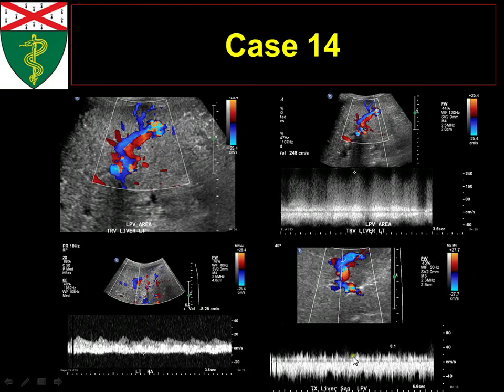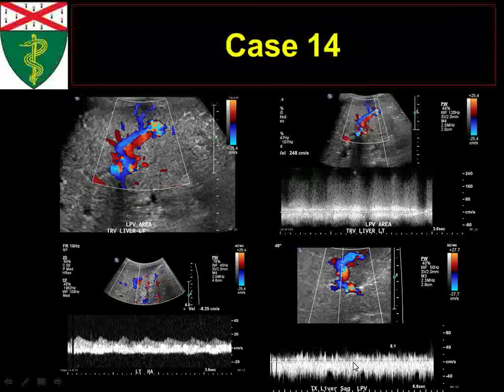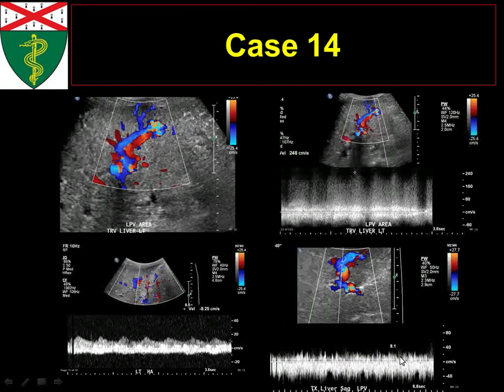Perfect. And what do we see in the portal vein? I'm trying to see if that's pulsatility. Absolutely. Remember, the portal vein is supposed to just be kind of undulating like that without these sharp upstrokes, and the whole portal vein is littered with sharp upstrokes here. So you've made all the findings. What do you think is going on? So there's probably, did this person have a biopsy? Absolutely. So it's a fistulous connection between the arterial and portal system.